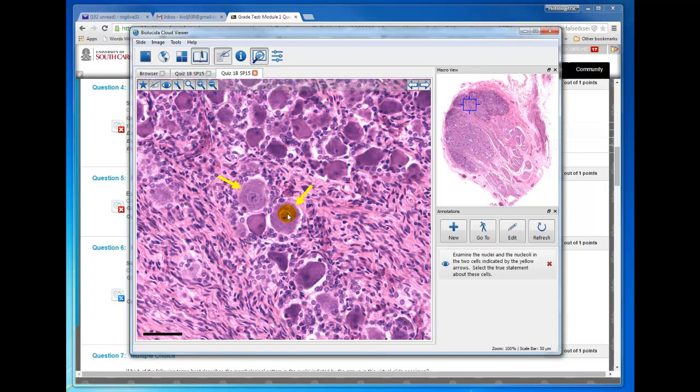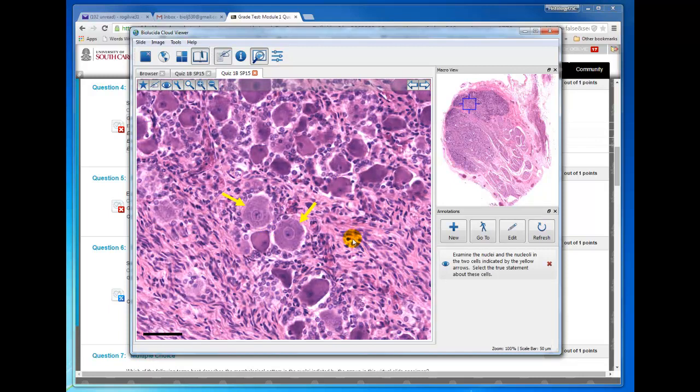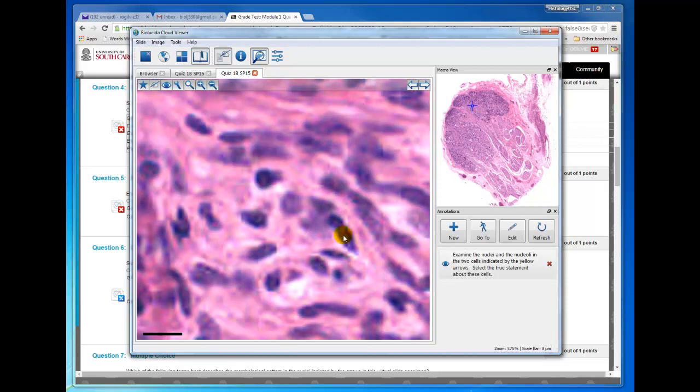the dominant pattern. Now you could enlarge this more by pressing the Z key on the keyboard and using your marquee, and you can just look at this area at higher magnification. And it's a little blurry because we're looking at empty magnification, but you can still see here that the chromatin pattern is very euchromatic compared to the pattern in the surrounding cells, such as these fibroblast nuclei here, which is all heterochromatic. It's a dominant heterochromatic pattern of chromatin.